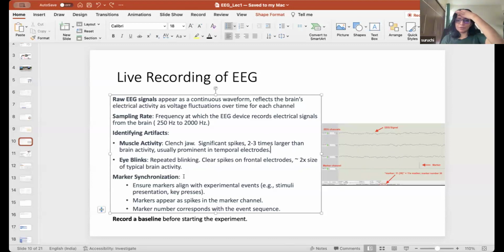So this FP1, FP2, that is why they're very important. You definitely note a huge signal. If you're not seeing this go up to twice the size of this, then something is wrong, and you need to contact your service provider, Aerobe. The people who do ERP studies, like I was saying, right?